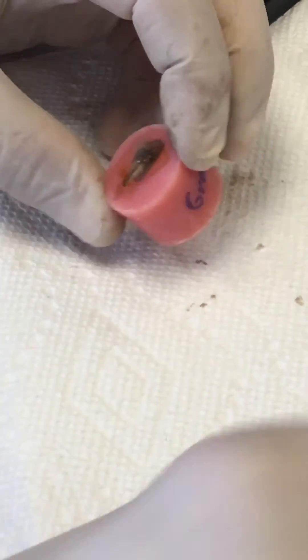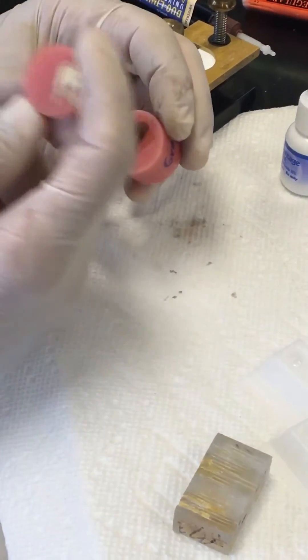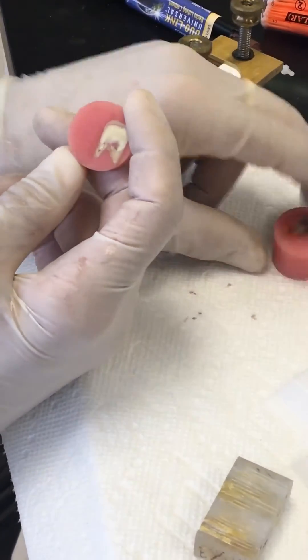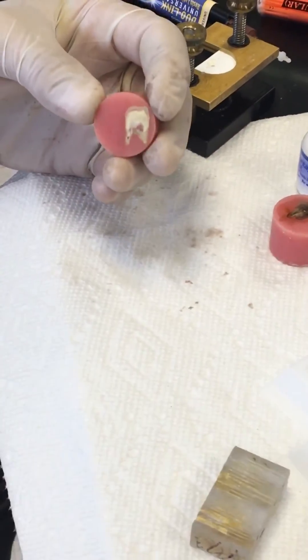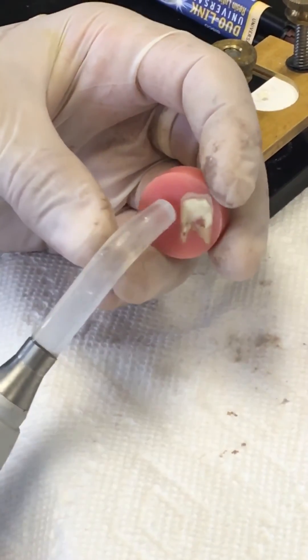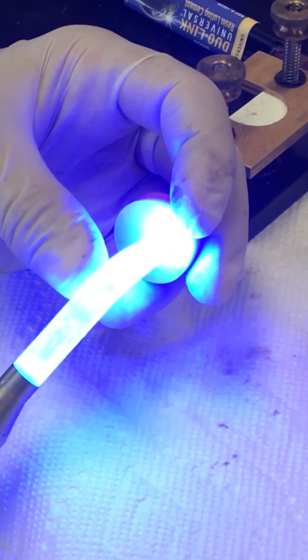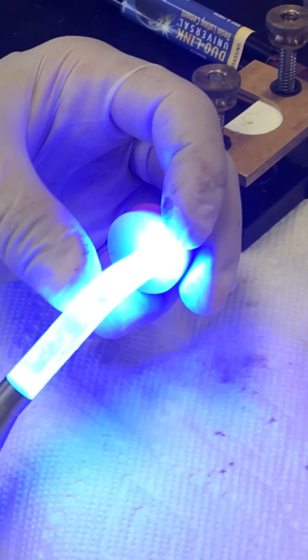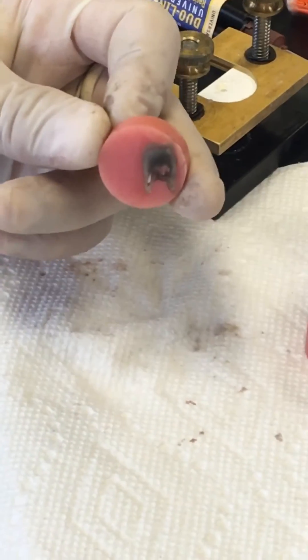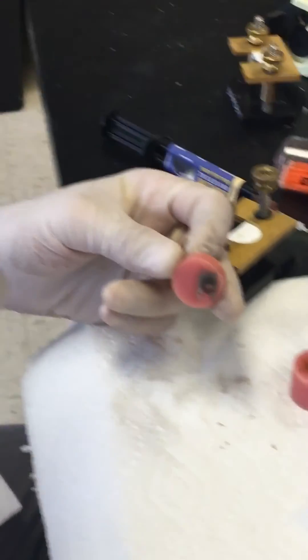Here's the thing, Dr. Ken — this one has silver diamine also. I applied it on both. But this one has no adhesive. Arthur, who seems pretty smart — he's legit — he said, 'What if it's the light?' So this one has no adhesive. I'm going to hit it with the curing light. Just silver diamine — that is insane. It is the light.